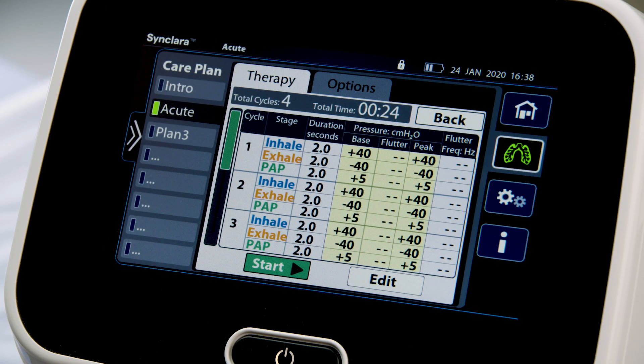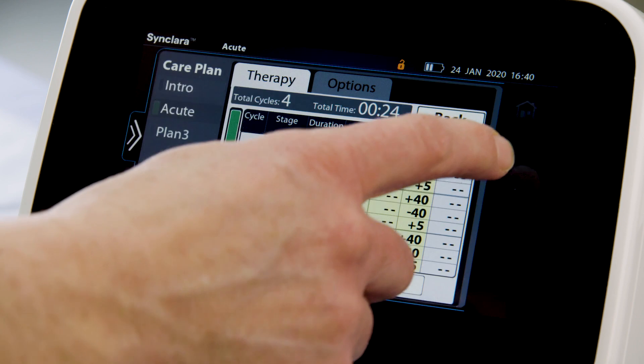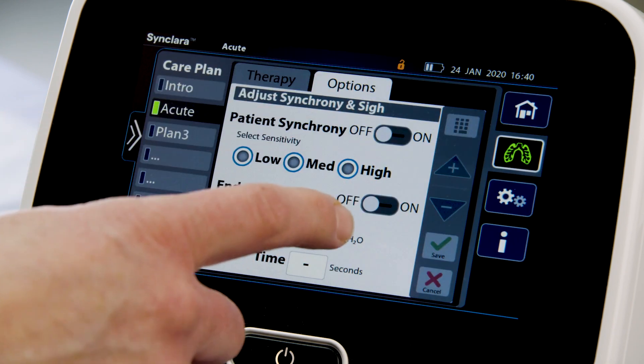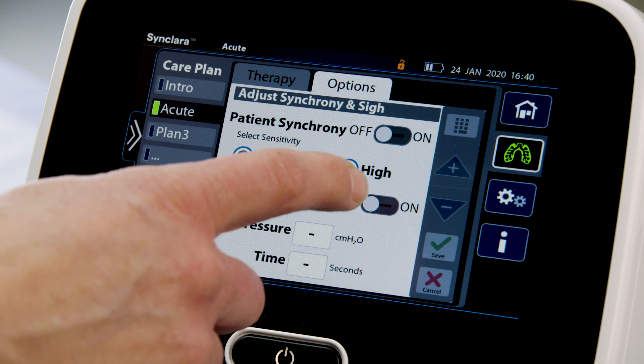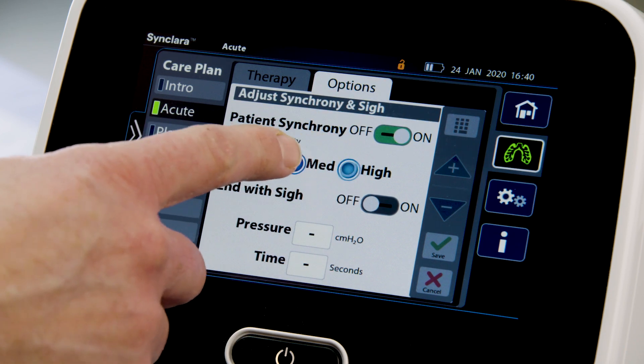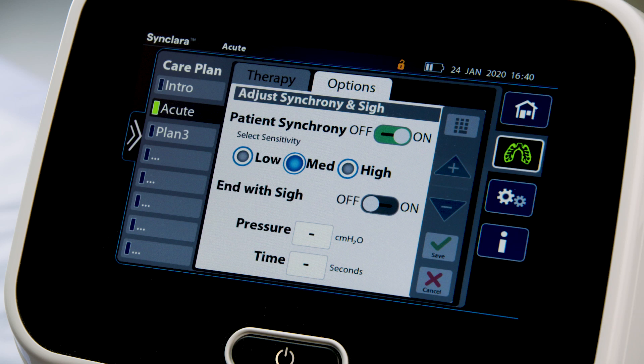Review the therapy settings to make sure they match the prescription; select another plan if required. If required, press Options to enable, disable, or adjust the settings for Patient Synchrony and End with Sigh. To enable Patient Synchrony, slide the setting to On and select the preferred level of sensitivity.